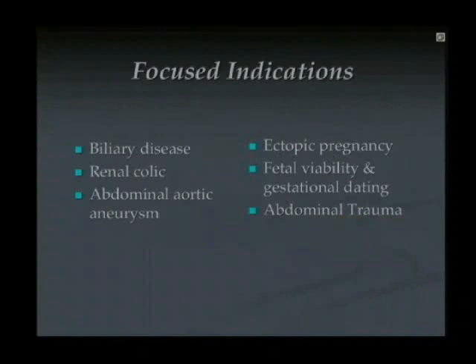I'm going to talk about biliary tract disease, and I'm also going to talk to you about the aorta. A little later, we're going to discuss the kidney. We're also going to talk about the pelvis a little bit later. And Dr. Swadron will come in and talk about abdominal trauma. So let's now focus just on the right upper quadrant and as well the abdominal aorta.